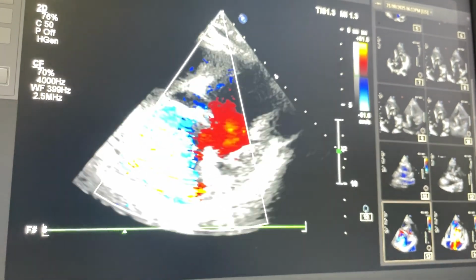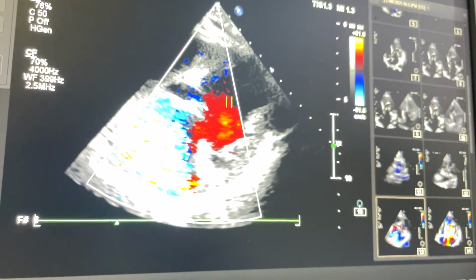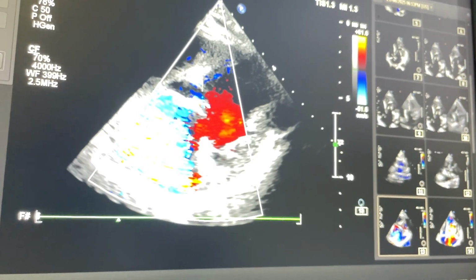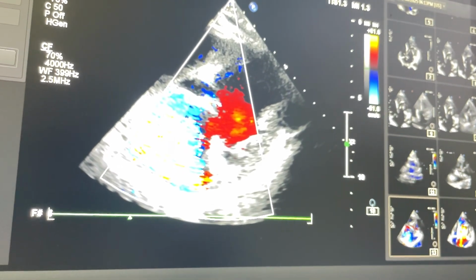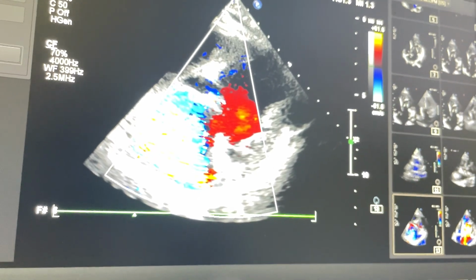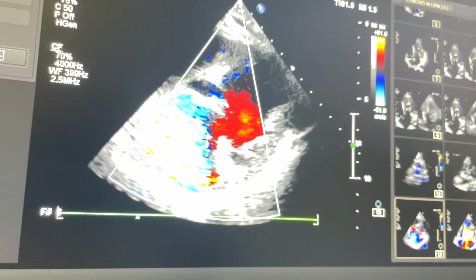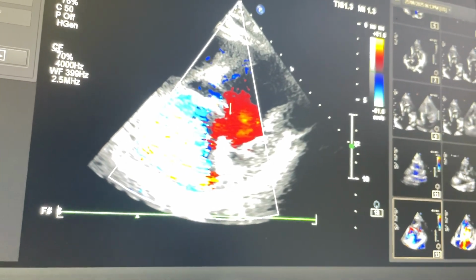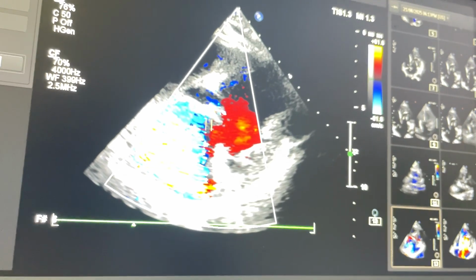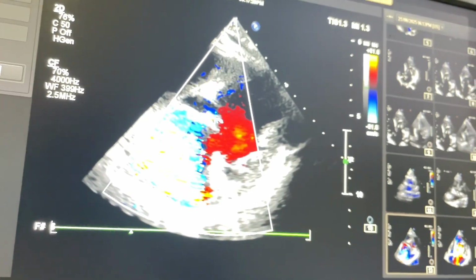is severe TR jet, because the right ventricle is unable to pump properly. Ultimately, right ventricle is failing. The valvular mechanism, tricuspid valve, is not managing. So severe TR, that is why patient is experiencing shortness of breath, especially when patient makes any kind of exertion. During the labor pain, patient made exertion and had a complaint of shortness of breath, especially during the labor pain. That is the point of severe TR.